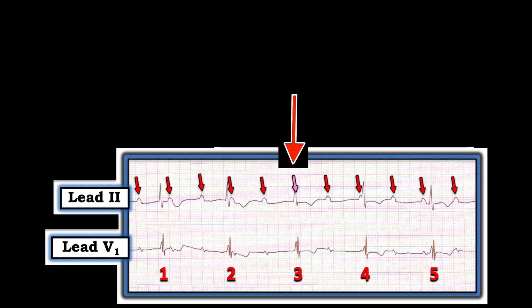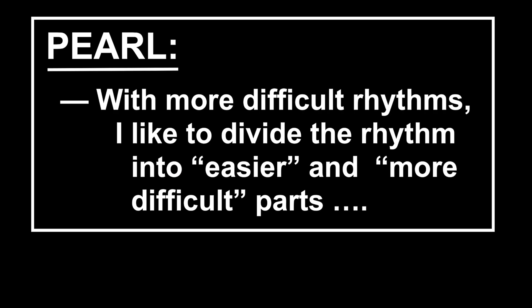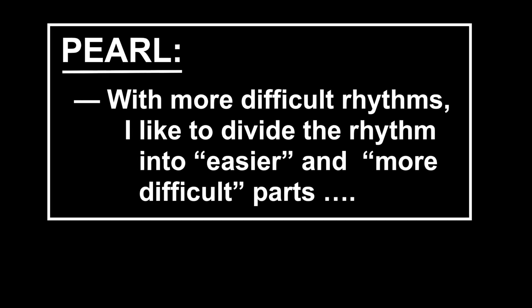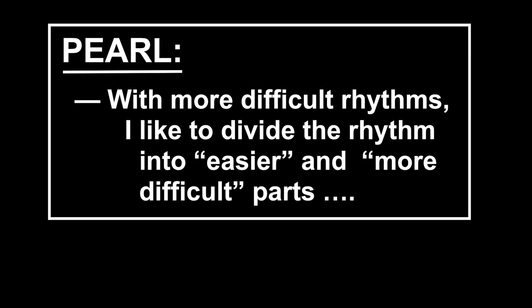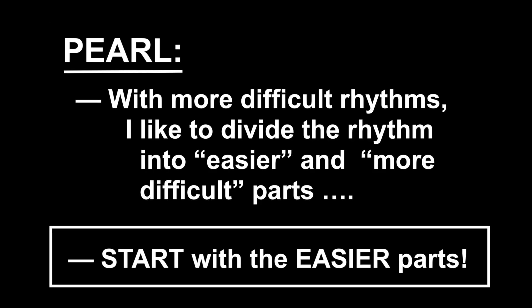Why did I use a pink arrow? Because it's hidden within the QRS. Am I 100% sure that there's a P wave in here? No — because the QRS is covering it. But this is an important concept. With difficult rhythms — and this is a challenging rhythm — I always divide the rhythm into easier parts and more difficult parts, and I like to start with the easier parts.